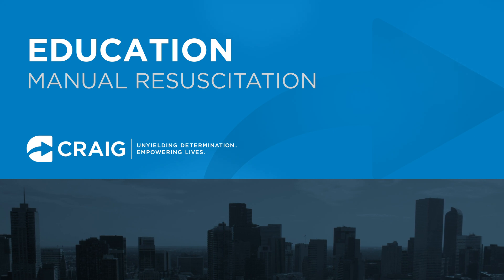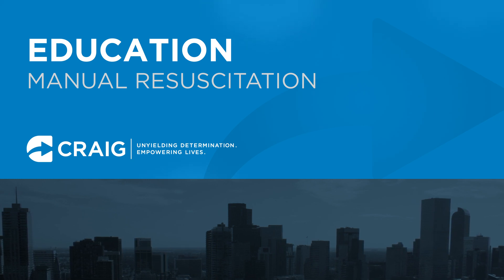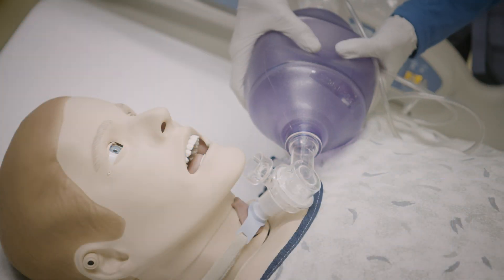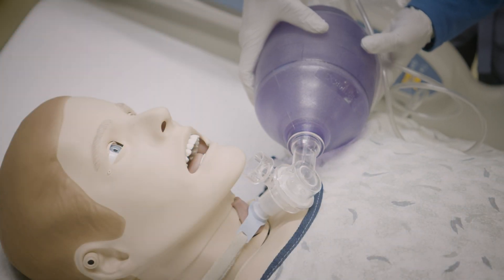If a person develops breathing problems, a manual resuscitator is the device that allows you to breathe for the patient who is in distress, has an emergency, or becomes unresponsive. A manual resuscitator allows you to push air into the lungs of a person.